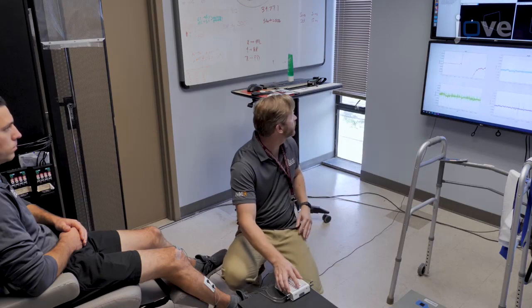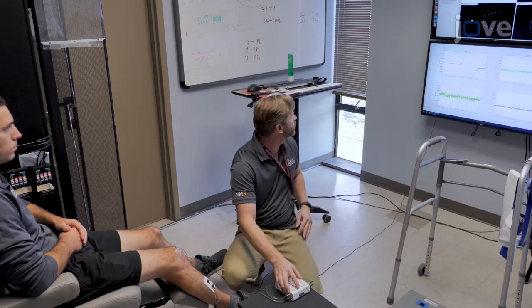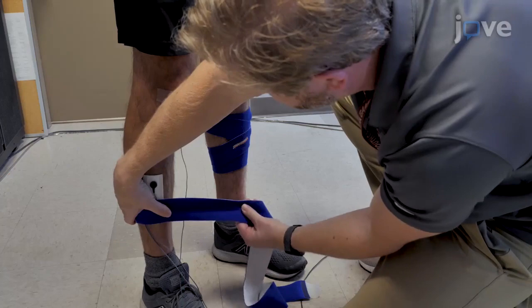Begin by visually inspecting the signal quality once the electrodes are attached. Then wrap the shanks with an elastic bandage to minimize any movement of the electrodes and the resultant artifact during testing.